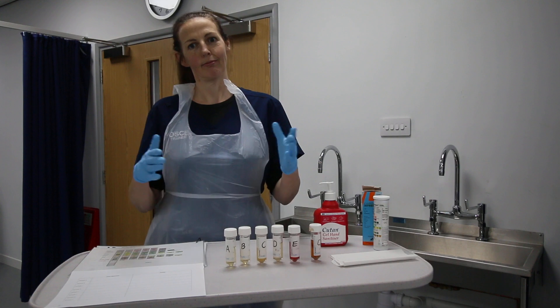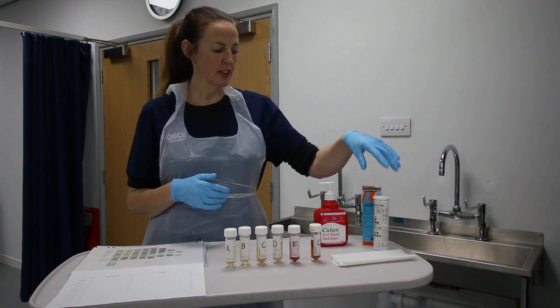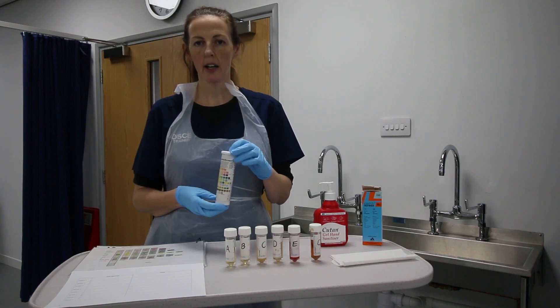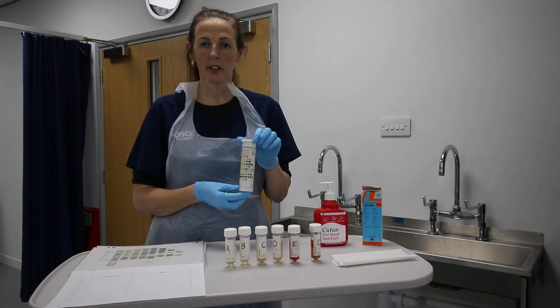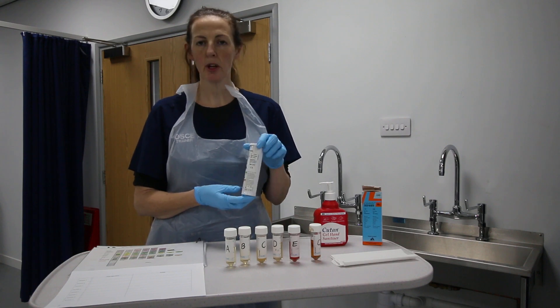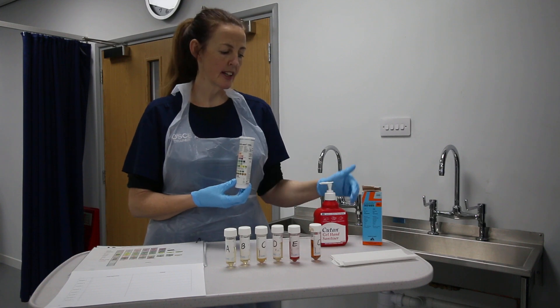I'll give you a quick overview of the possible samples you might come across in your OSCE. We'll be sampling with a multi-stick such as Combi Screen. As part of your requirement to make sure your equipment is sound and working, you should check the expiry date on it and make sure the box is sealed and has only been opened as per manufacturer recommendations — usually no more than one to three months, which you can read on the side of the box.